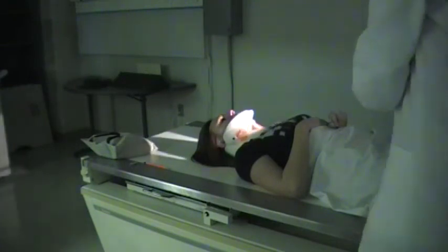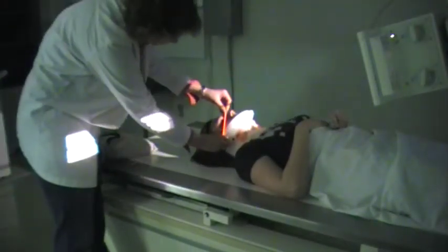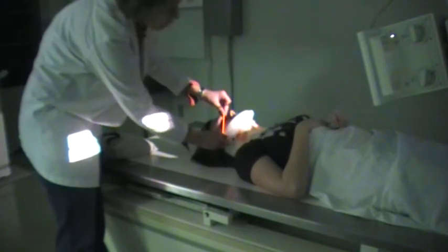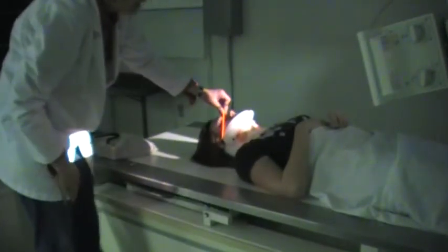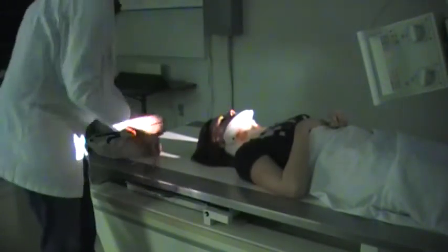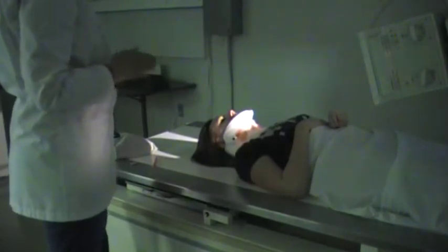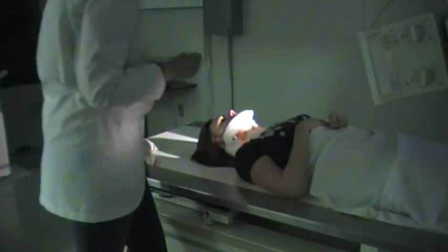Now, when you do the SMV, we're looking at our IOML, and we want the central ray to hit this perpendicular. Now I'm going to get it as close as I can, being that we can only work with her in the neck brace. She cannot throw the chin back. So I'm going to bring her arms down.